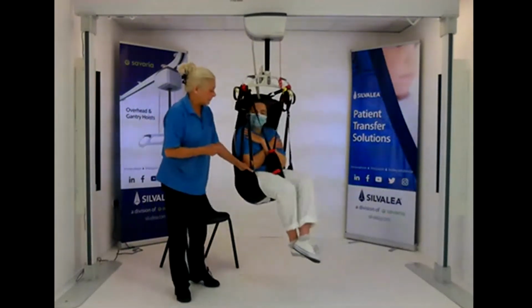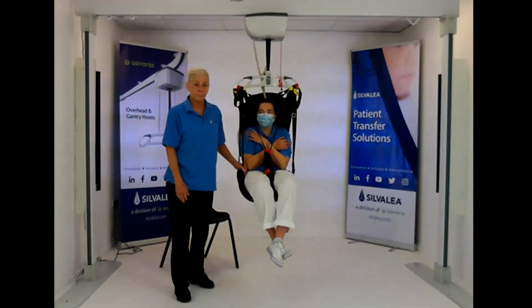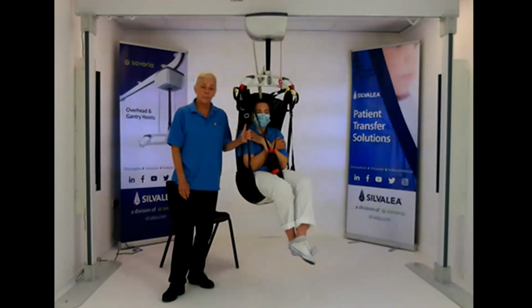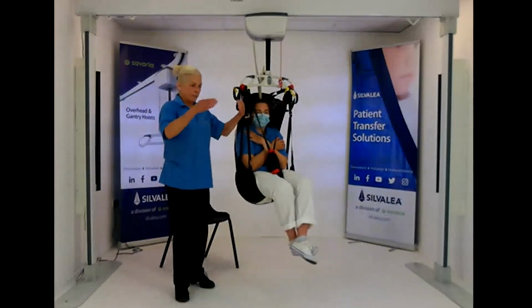But I don't know. Let's see if there's any questions and how I can help with this one. We have got a couple, Mandy. First one, do you always recommend building from the bottom with every sling, or doesn't it make a difference with standard slings? I do with this one because I like to know I'm building up.